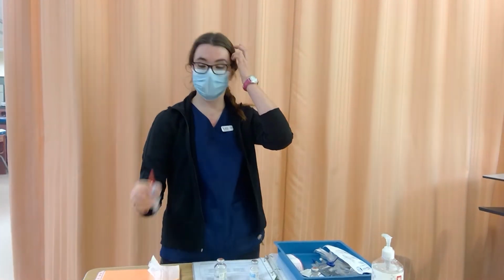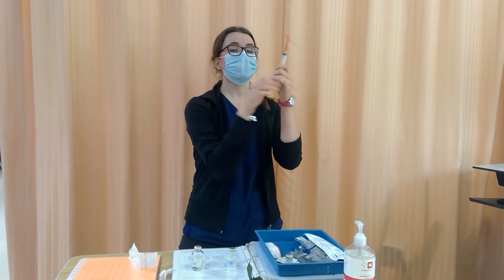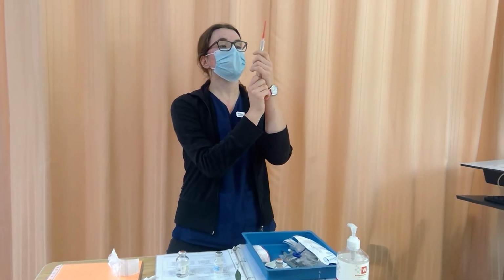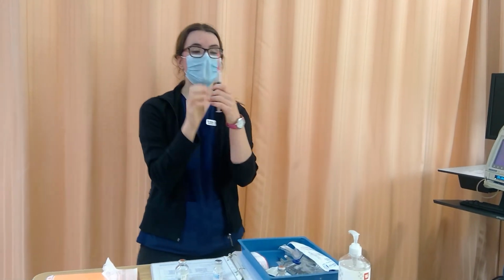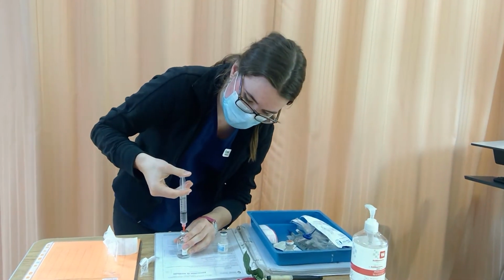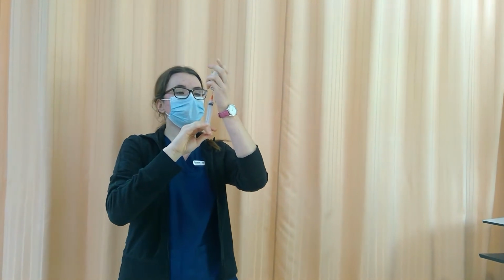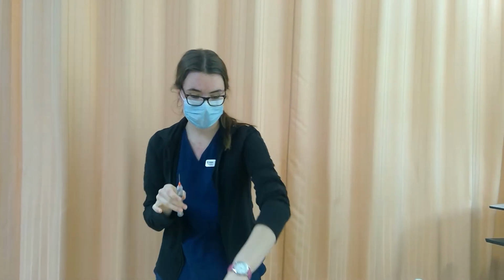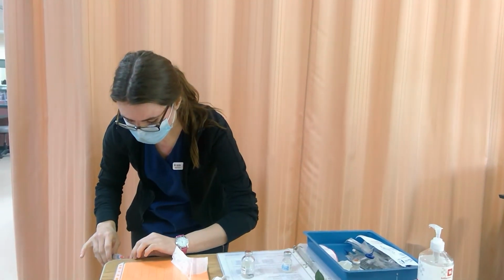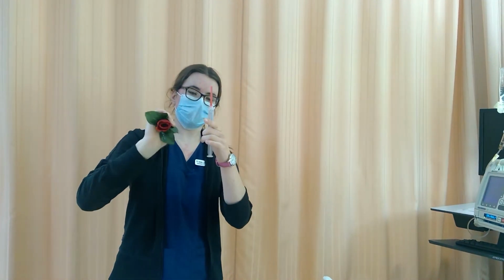Of course, for the demo, we don't really have time to do that. Since we are drawing up 2.5 million units, that's half of what's in the bottle, we're only going to be drawing up 5 milliliters because the final volume in here is 10 milliliters, and we only want half of the dose. So I'm injecting 5 milliliters and taking out 5 milliliters of medication, because that's half of what's in this bottle, and we only want 2.5 million units instead of 5 million. So, drawing back, tap out my bubbles.